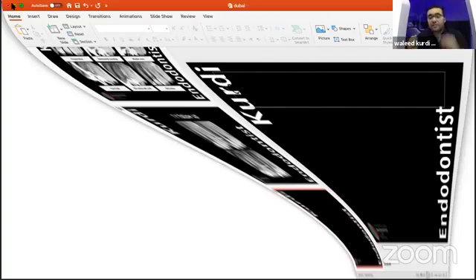And the silver one is very good also, but more in activation of the irrigant in straight canals. And the blue one is more flexible, and you can use it to activate the irrigant ultrasonically in curved canals. So we have 3 tips. The gold one, better for retrieval, and the silver one, better for activation in straight canals, and the blue one is better for activation in curved canals.